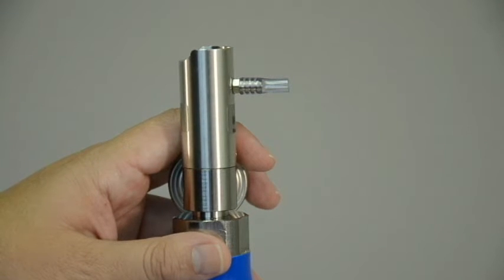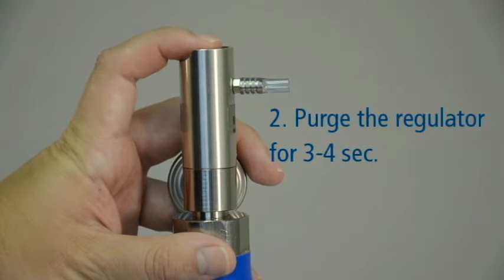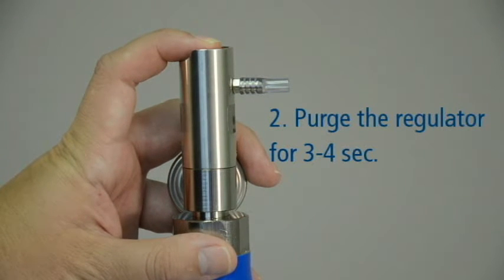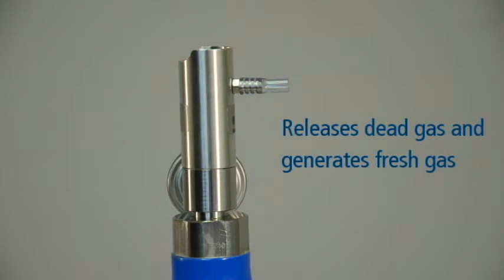Before performing the accuracy check, it is important to purge the regulator. This is done by pressing and holding the button or valve on the regulator for 3 to 4 seconds. Purging the regulator releases any dead gas that may be present and generates fresh gas for the purpose of your accuracy check.